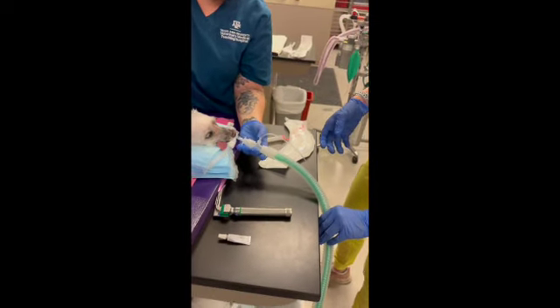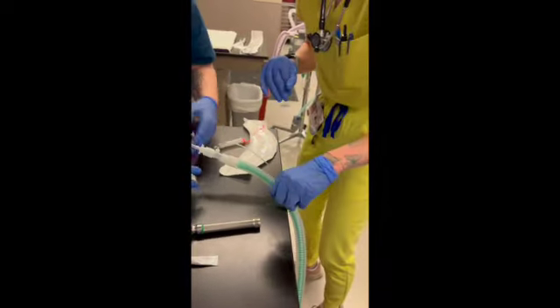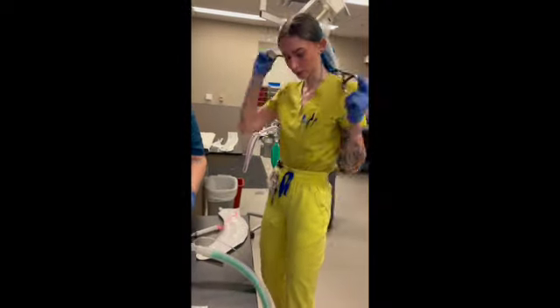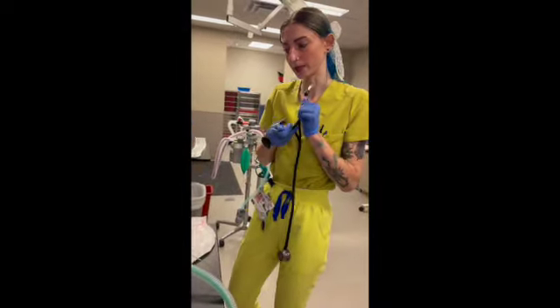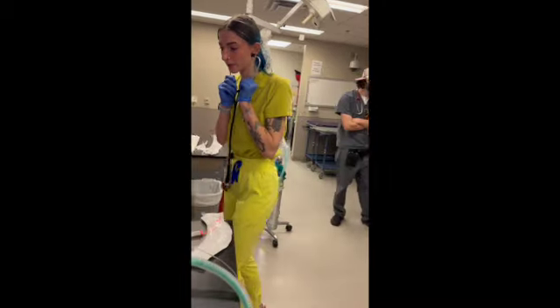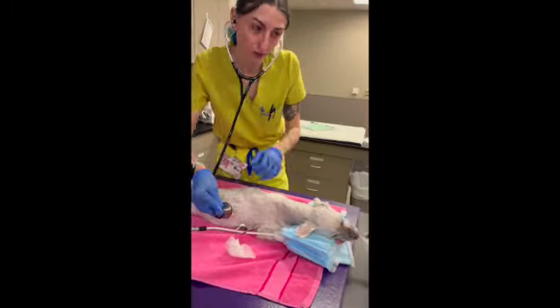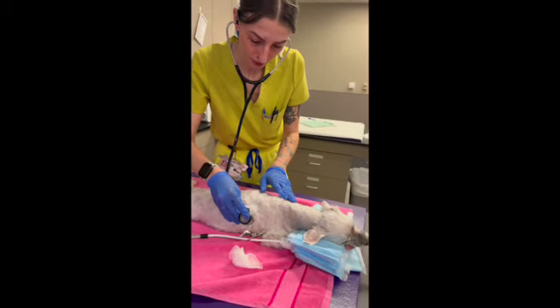Alrighty. Good job. And our student is continuing to breathe for him. And so you also want to auscultate both sides of the lungs to make sure that both sides have been intubated and not just one bronchus. So if you wouldn't mind just giving some breaths.